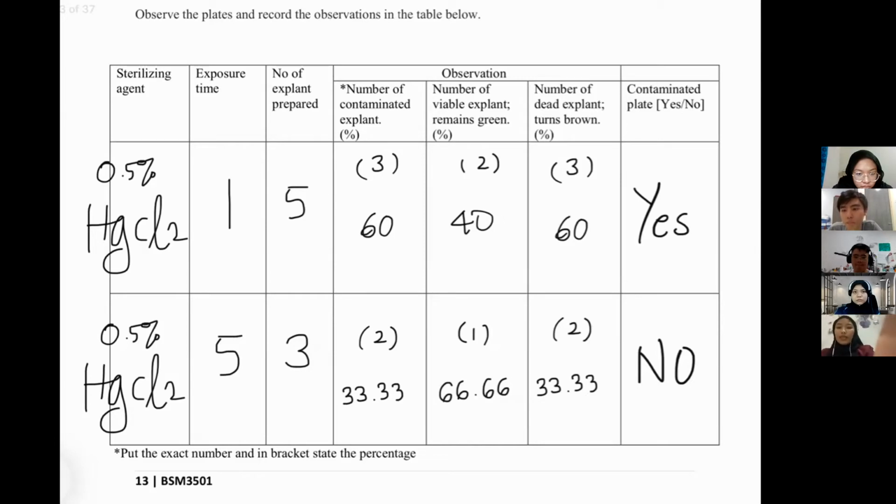For the 5 minute exposure time, I use 3 explant, with 1 viable explant and 2 contaminated explant. So I got 33.33% contaminated and 66.66% viable explant. So the number of contaminated is lower than viable explant, so it's not a contaminated plate. Sorry.